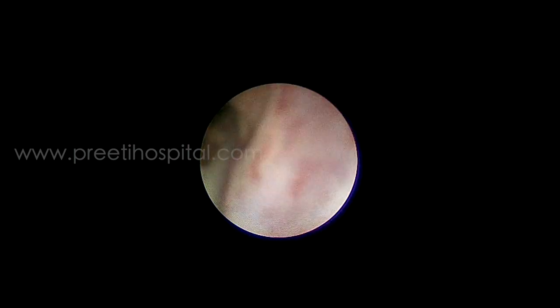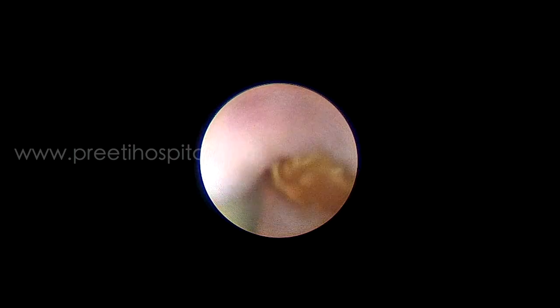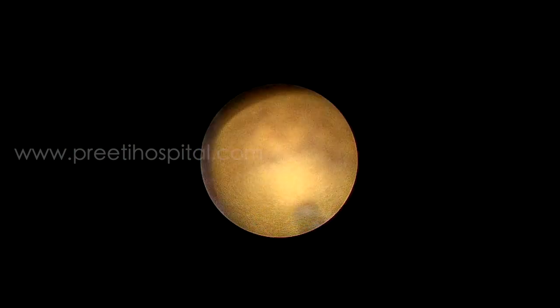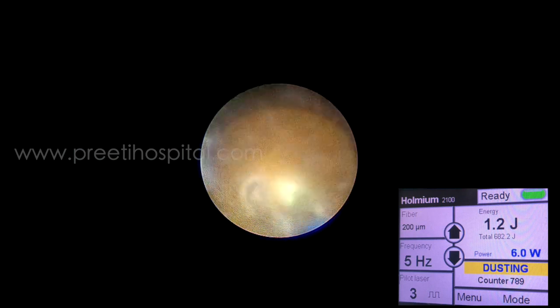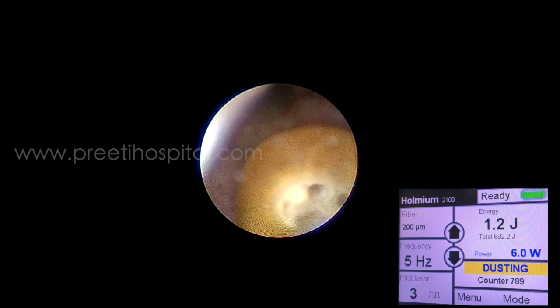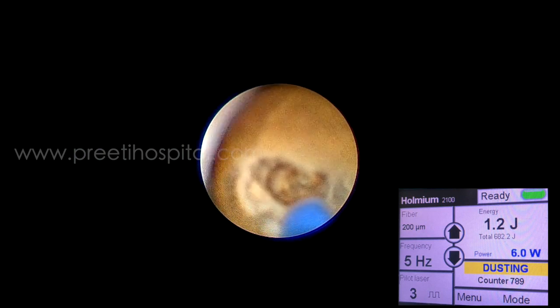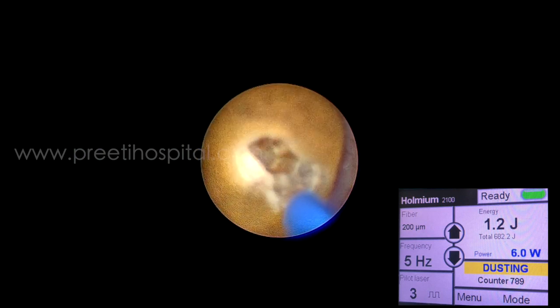With the guide wire in situ, the ureter is re-entered and with the stone in the proximal dilated part of the ureter, laser lithotripsy is done. 5 Hz and 1.2 joules — that is low frequency and high energy settings — are used, and the laser is started from the center of the stone.